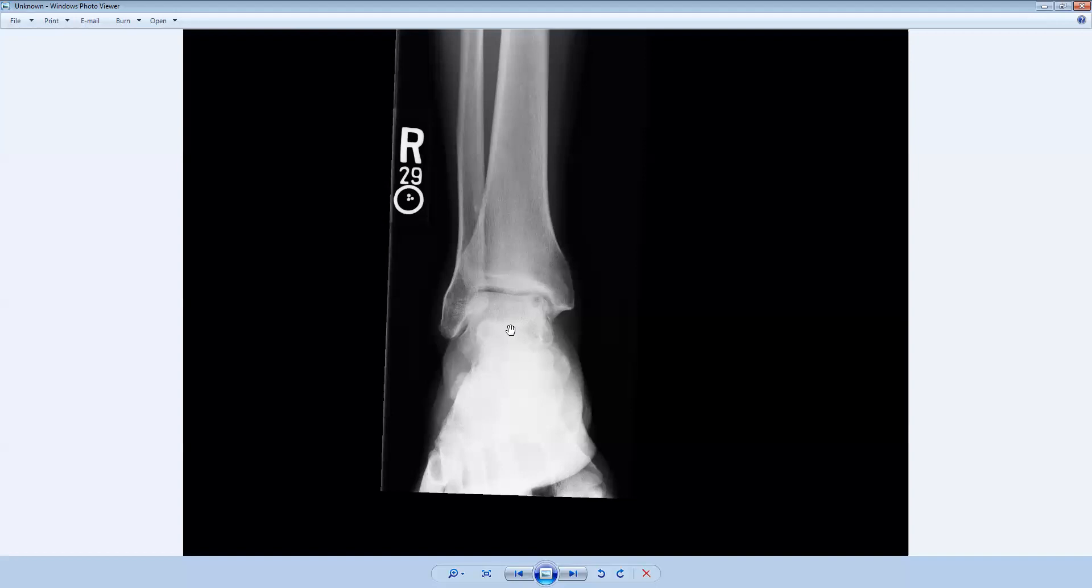These are important injuries to document because they can be stable or unstable. Usually the way we identify them as being stable or unstable is by getting more advanced imaging like an MRI exam. There are certain criteria that we look for to evaluate for instability. For example, if there's cystic change around the lesion or if there's fluid undercutting the defect on an MRI, those are signs of instability.